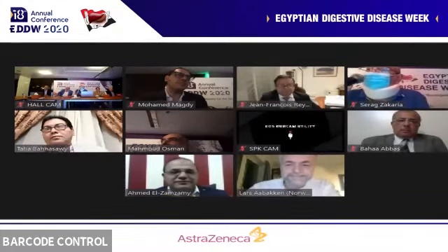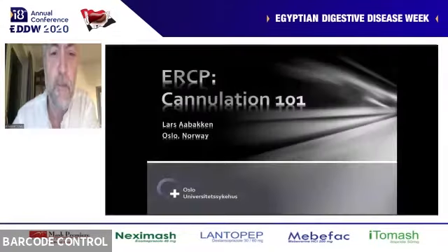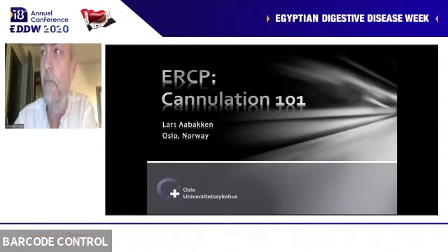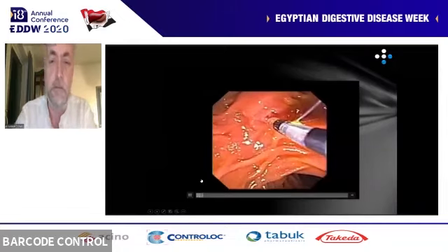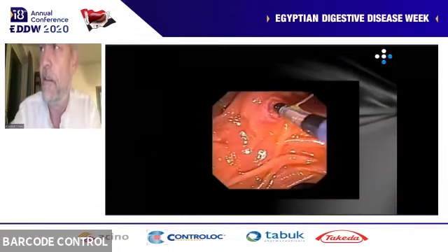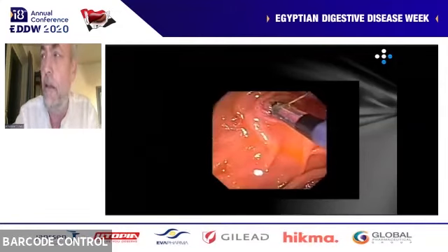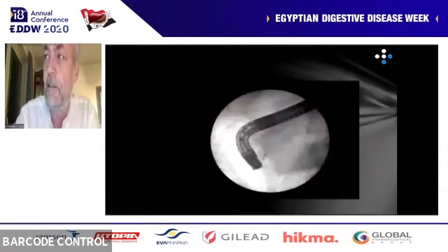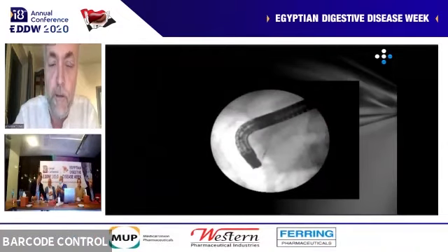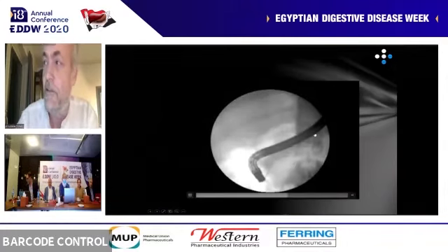Please. Fantastic. Okay, so I was charged to talk a little bit about ERCP and the aspects of cannulation. As you know, when you do ERCP, this is what you want to do. You want to find your papilla in a nice position. You want to pass your guide wire and insert your catheter and fluoroscopically confirm that you're in the right duct. So this is your ideal situation.